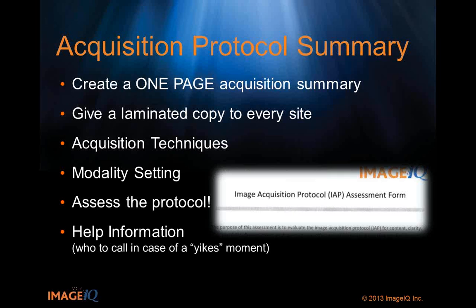And again, it's part of the engagement process, right? They know they're involved and they made a decision. I know what we've done for many of our clients is we go through this assessment process. Ultimately, it makes your image acquisition protocol better and more reliable. Just take the time up front. An ounce of prevention is worth a pound of cure. Take the time up front to go through an assessment of the acquisition protocol. It will save you a ton of headaches later on in the study.